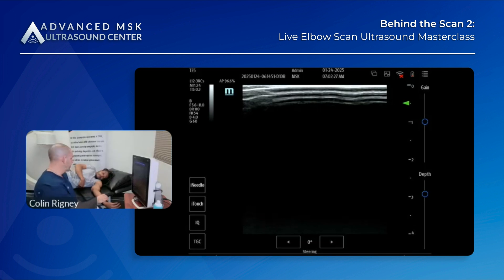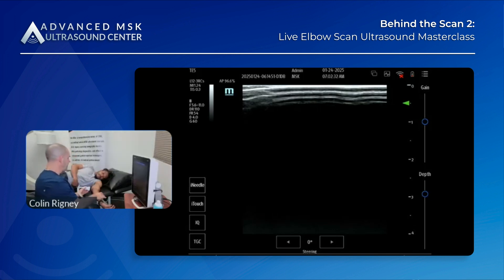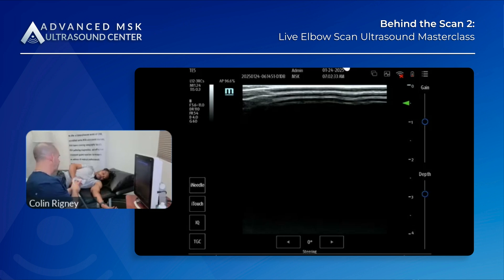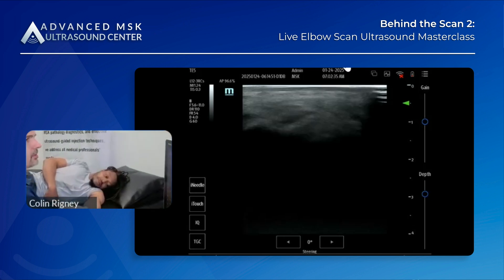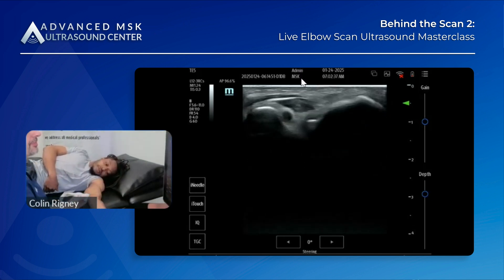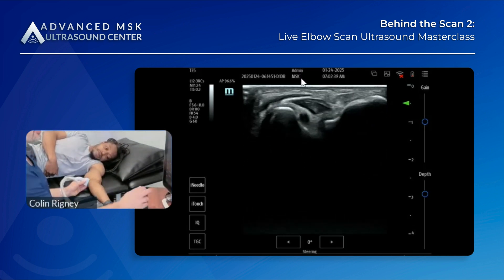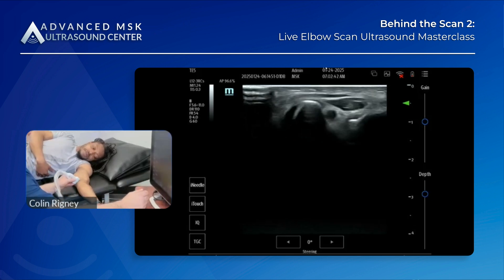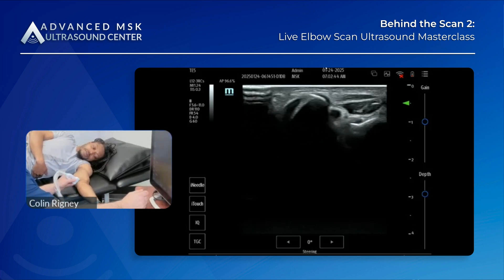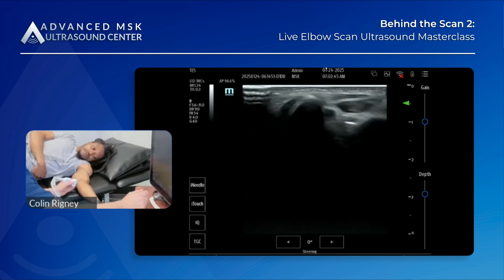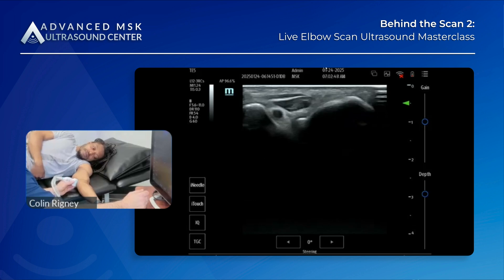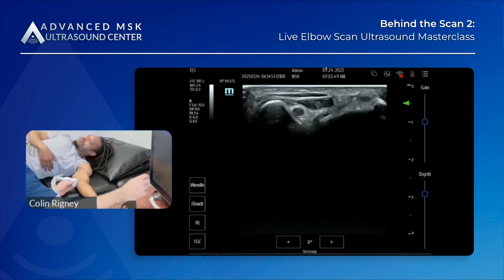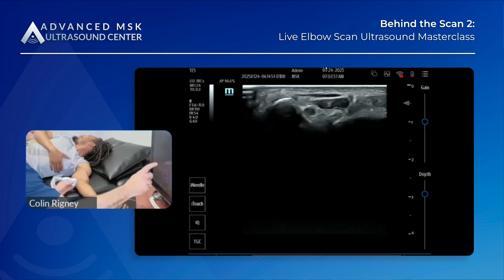Evaluating the ulnar nerve, we're going to start with the patient in the same position, sideline. I'm going to extend the elbow and find the cubital tunnel. I'm looking for two bony landmarks: the medial epicondyle on the left, the olecranon on the right, and this circumferential structure right in the middle.